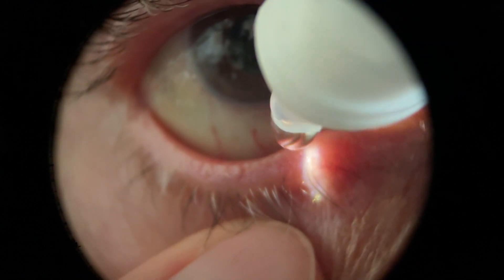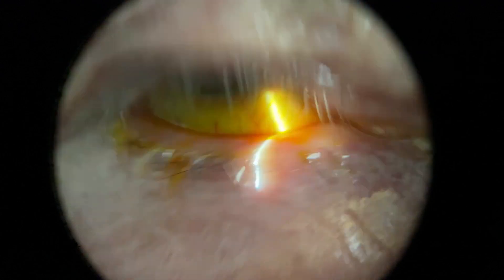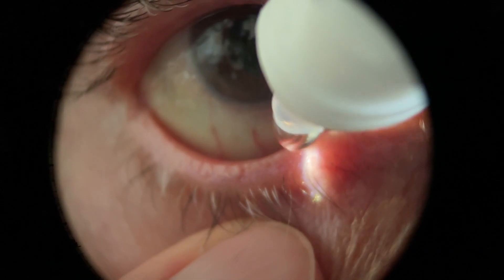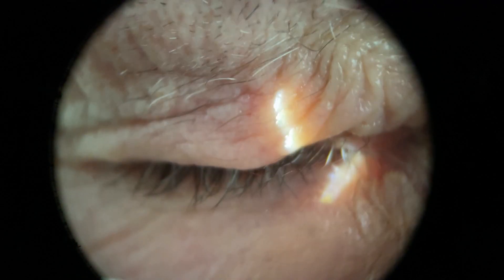All right, so let's start with the step-by-step guide. First, you're going to want to apply an anesthetic eye drop to the patient's eye and put in some fluorescein dye. Some clinics have combination eye drops which contain both of these agents. The anesthetic drop can hurt pretty badly, so tell the patient the burning is going to go away after about 10 seconds, and give them a tissue in case the eye starts tearing.